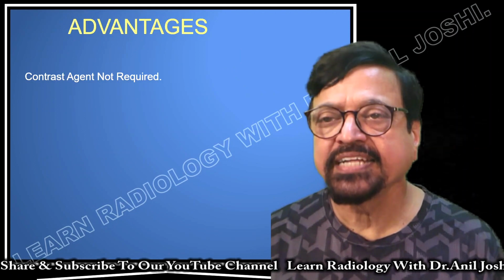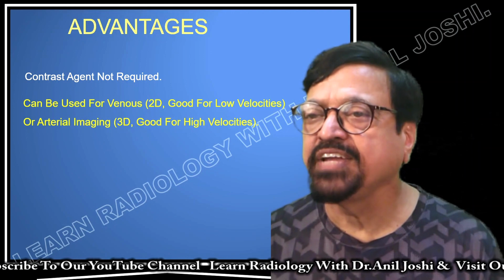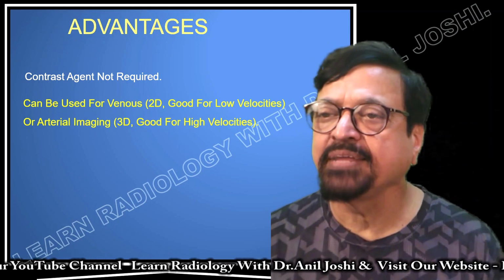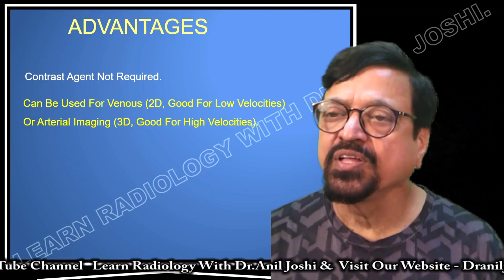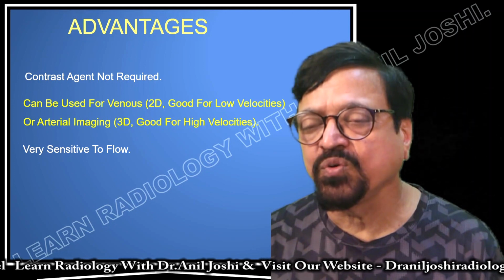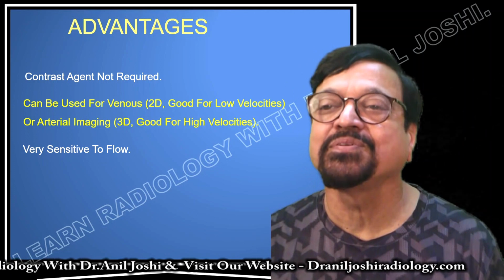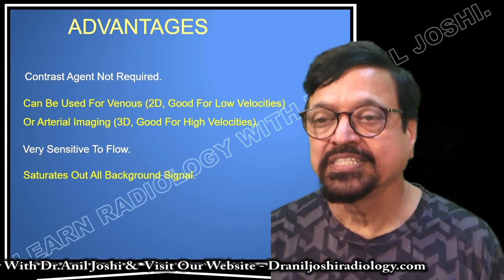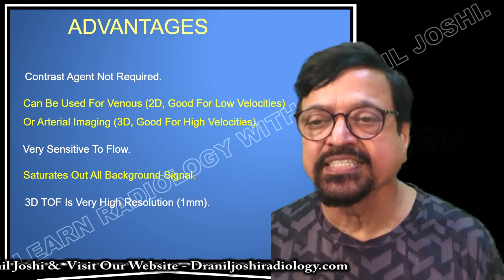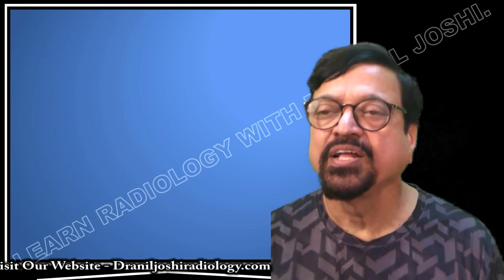Now what are the advantages? Contrast agent not required. It can be used for venous imaging, that is 2D, good for low velocities, or arterial imaging, that is good for high velocities. Then it is very sensitive to flow. The sequences I told you just now are very sensitive to flow. It will saturate out all background signals. 3D TOF is very high resolution, that is 1 mm.